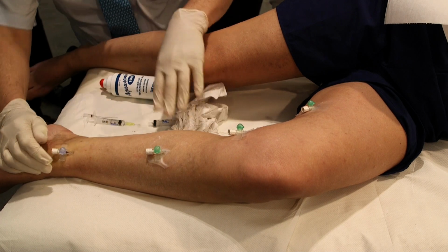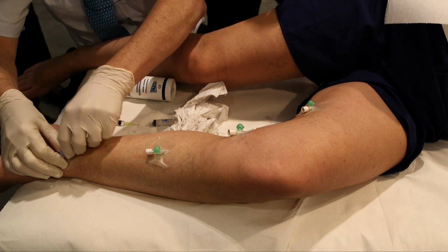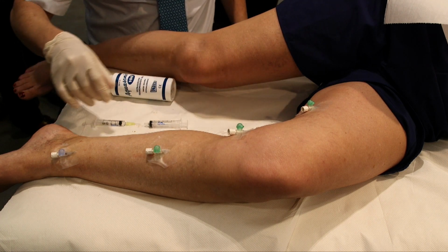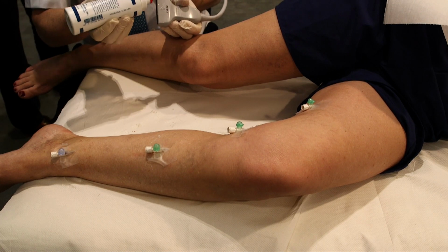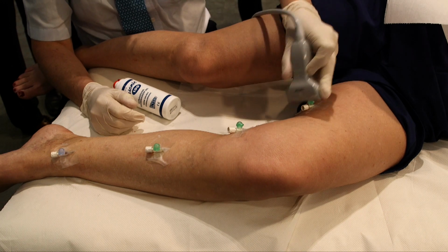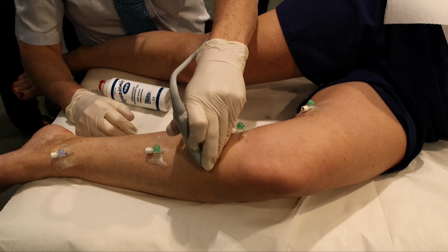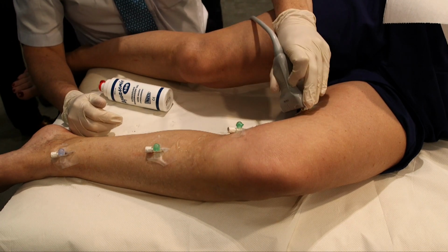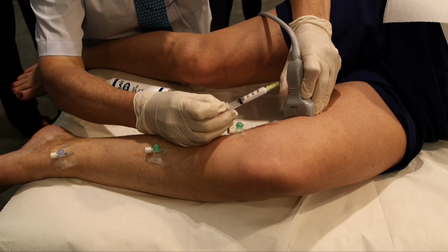Make sure it sticks, because we've got to have a change of position in a minute. I think, Kate, we'll just inject a little bit of 0.5% STS foam into those little accessory veins, one here and one here. So I think a little bit of foam up here would be useful, and a little bit of foam into this accessory vein down here would be useful as well. These are actually the varicose veins that we're trying to get rid of. This is 0.5% STS foam, pretty feeble foam, but the veins are of modest size and rather superficial.